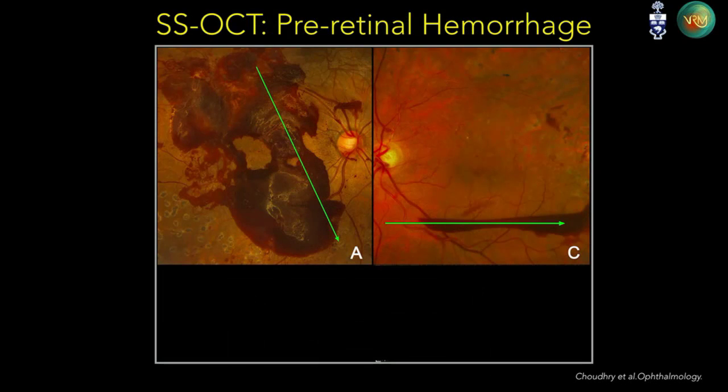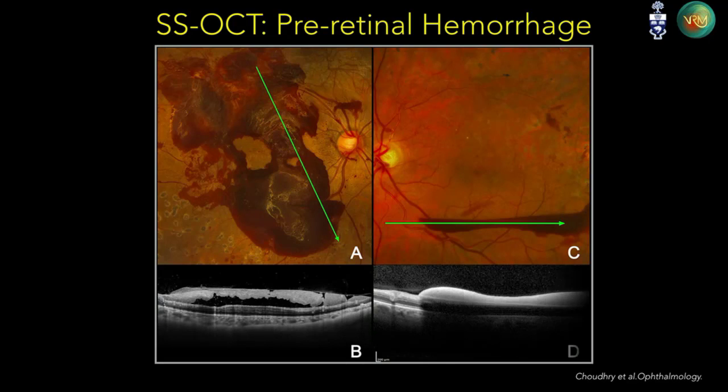So here's a nice head-to-head comparison of spectral domain versus swept source. In figure B is our swept source Triton image through blood, and on the far right in figures C and D is through spectral domain, a Heidelberg OCT. We have good technology at our disposal, but because of the shorter wavelength at 840, 850 for spectral domain, you get backscattering from the blood, whereas with swept source, you just cut right through it. So it's a significant advantage on those difficult patients where you'd otherwise break out a B scan and start looking at things in a different way.